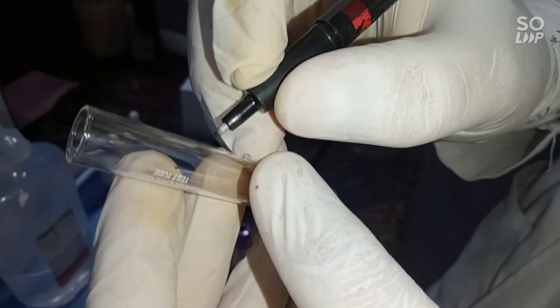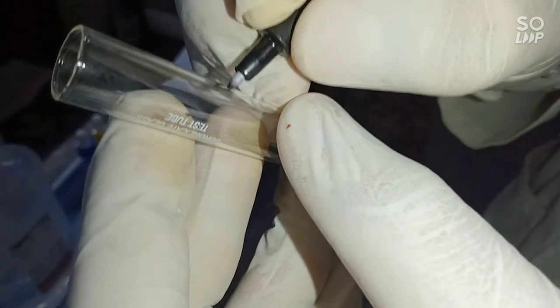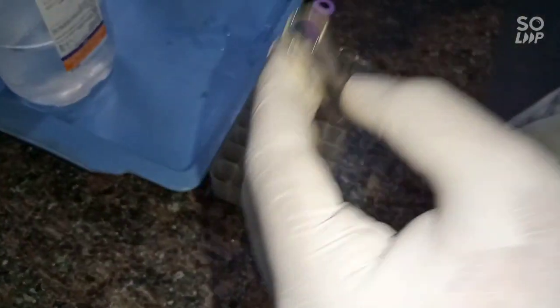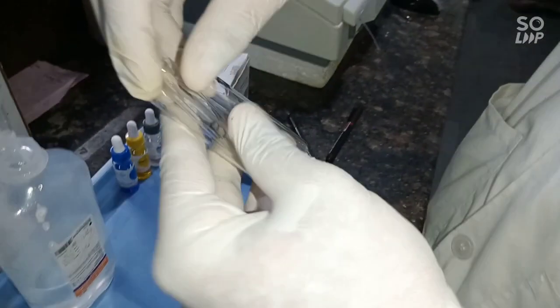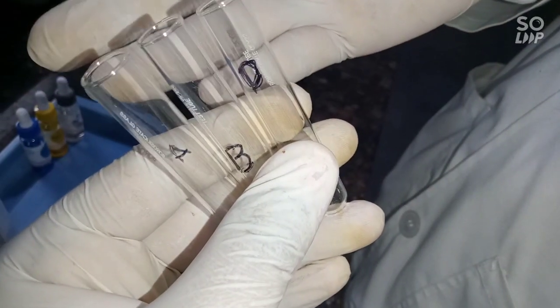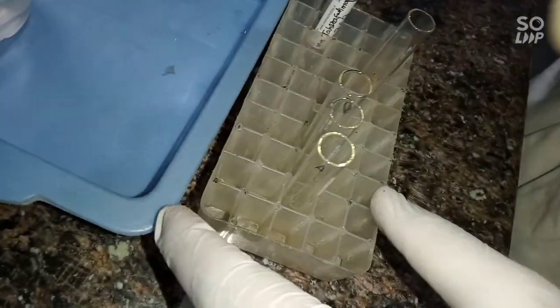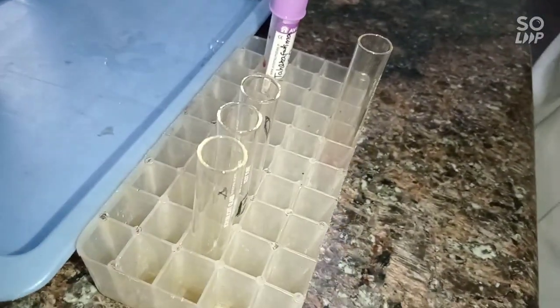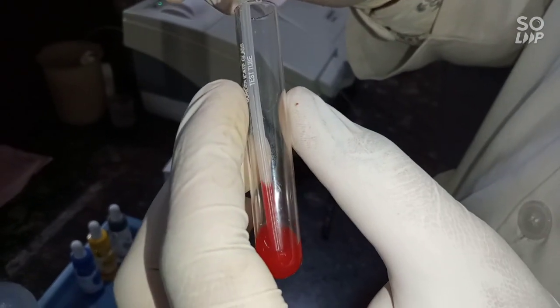After centrifugation, decant the tube and mark each tube with its respective antigen label. Take a new dropper and mix the sediment, then transfer the sediment — one drop into each tube.